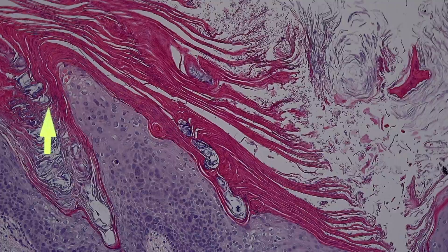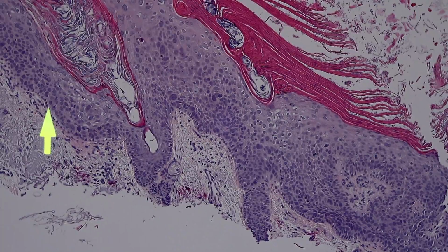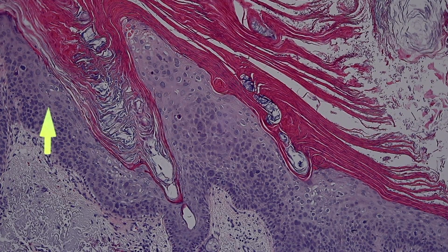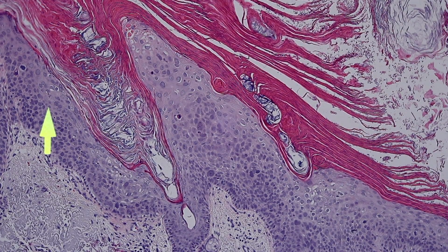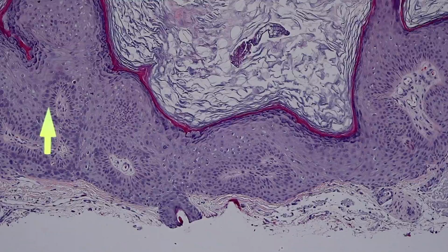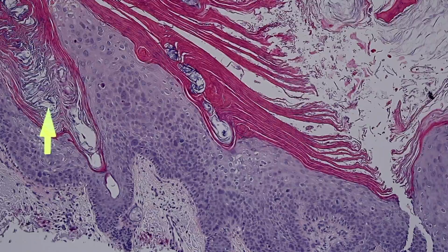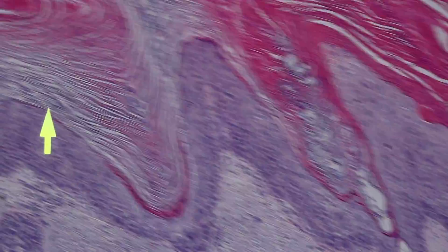And oh, by the way, the older name, or a name some people still use, is Bowen's disease. Bowen's disease is essentially a synonym for squamous cell carcinoma in situ. So if you're just starting out in Dermpath and you're not aware of that yet, now you know. If someone says rule out Bowen's, they mean rule out squamous in situ. So here is the seb over here that just happens to be colliding with next door neighbor squamous cell carcinoma in situ.